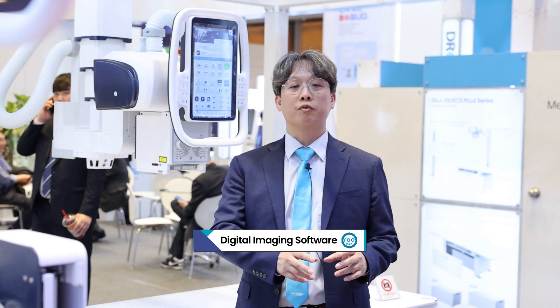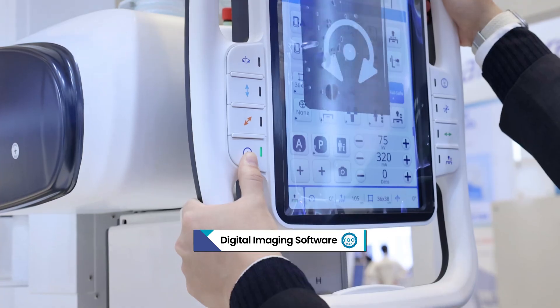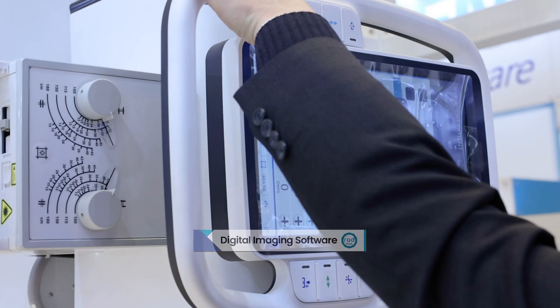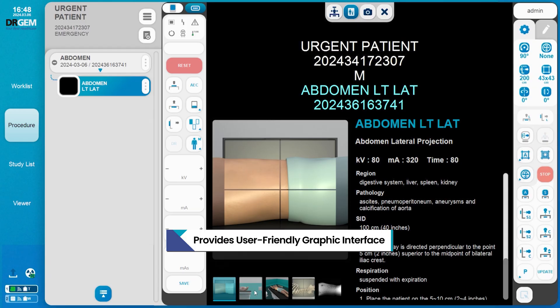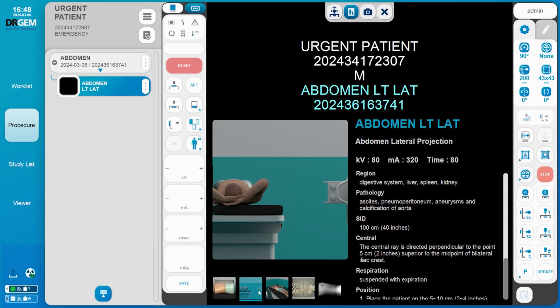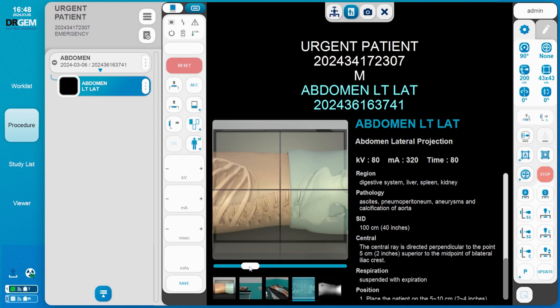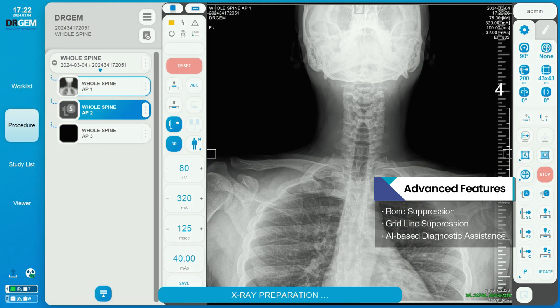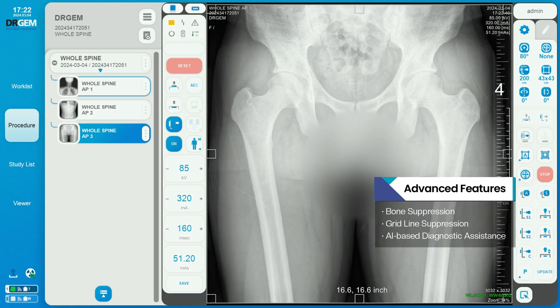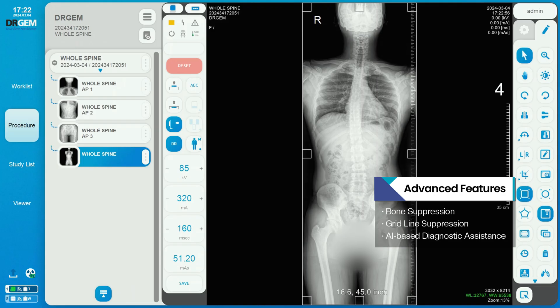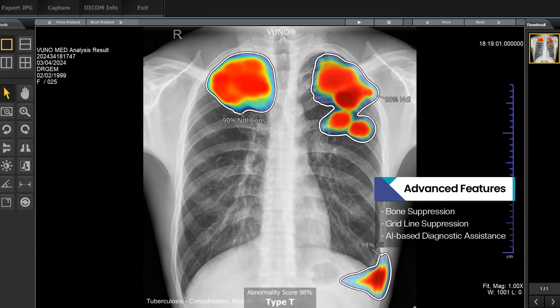Our AP system uses digital imaging software RadMax. RadMax provides a user-friendly and touch-friendly GUI like a mobile phone. Additionally, RadMax software provides advanced features like bone suppression, virtual grid, and chest AI solution to satisfy customer needs on image quality and user convenience. Thank you.